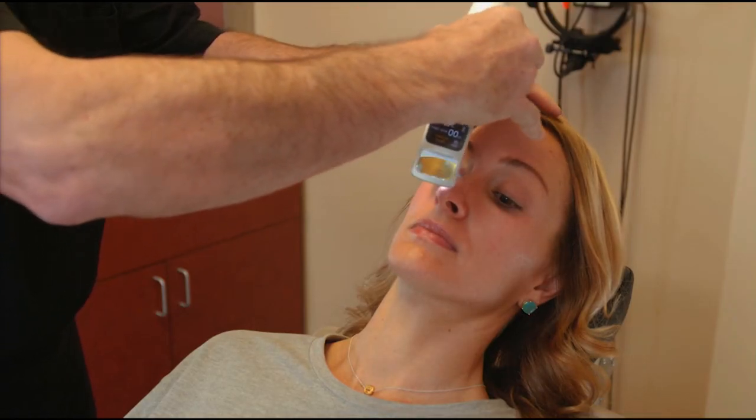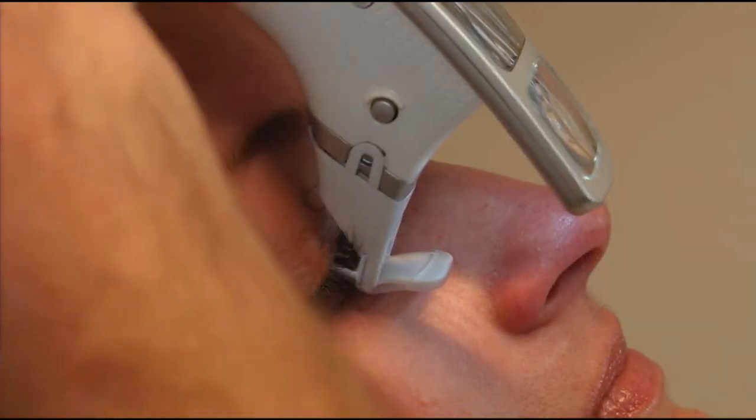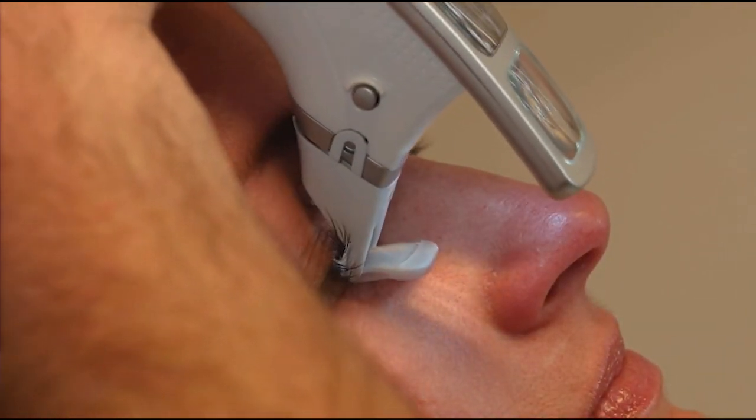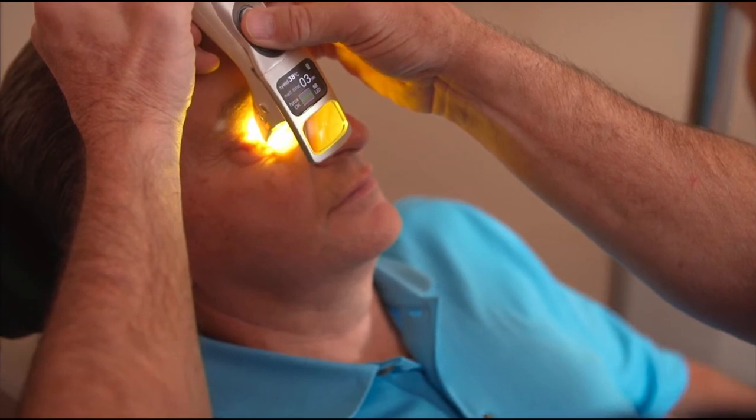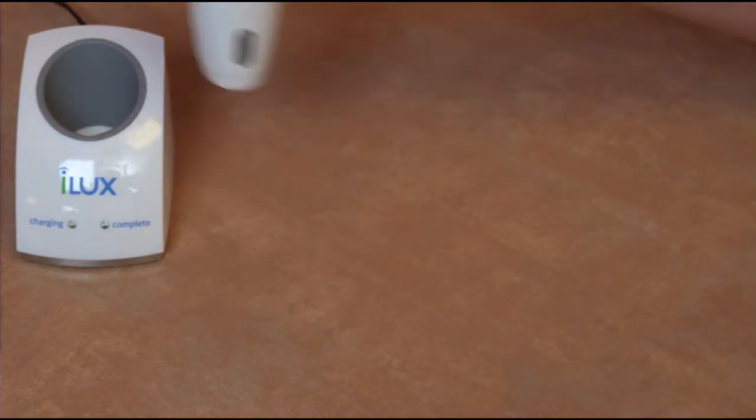Next, placing the smart tip in the upper lid, heating the upper lid, removal from the upper lid, and removal of the smart tip disposable.